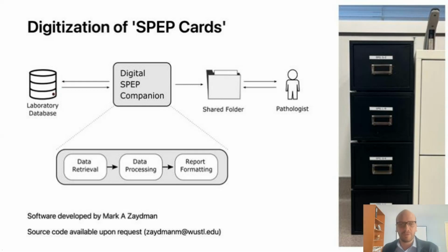I have developed a software package that takes these physical history note cards and automates the generation and updating and maintenance of those note cards. So what I'm showing you in this picture on the right, this was the file cabinet that the technologist needed to visit each day and retrieve up to, let's say, 80 different patient cards from their location, and then file them back at the end of the day. This was a very laborious step.